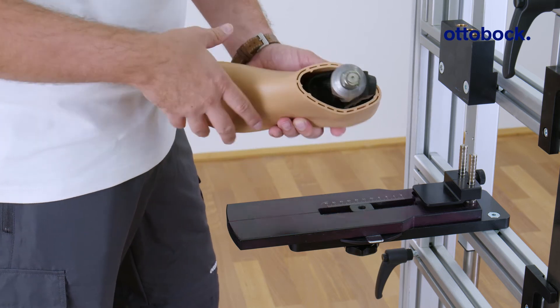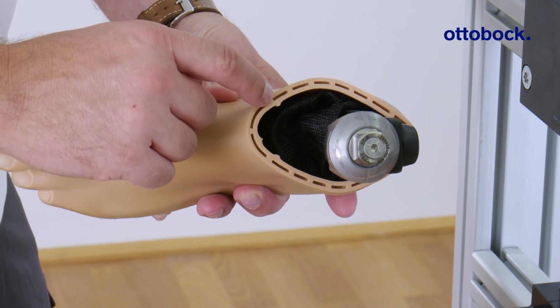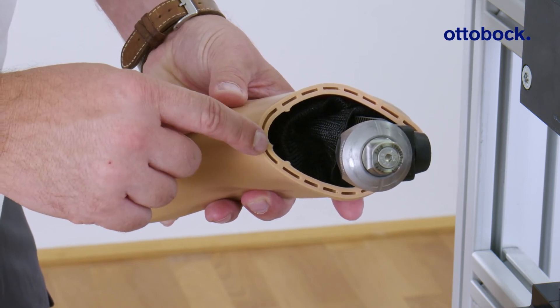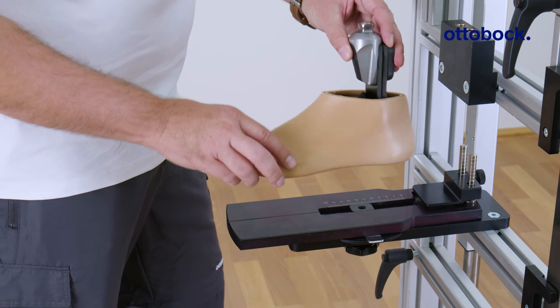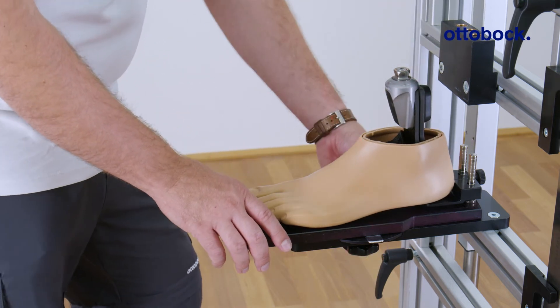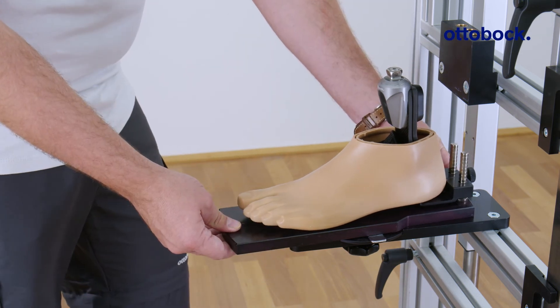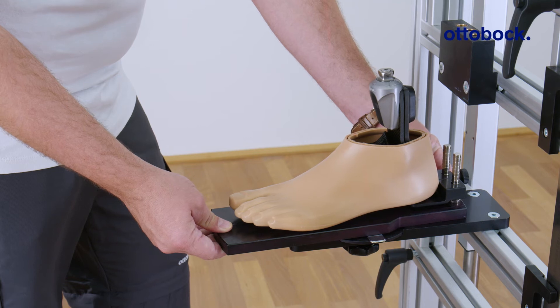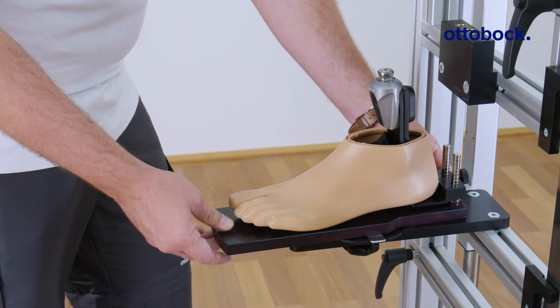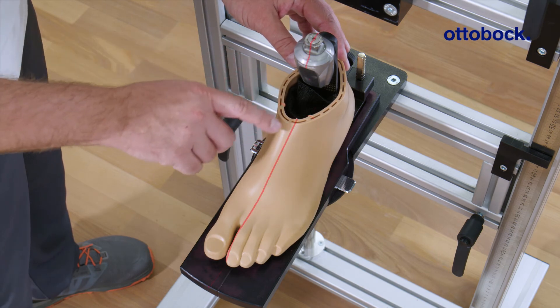Then remove the footshell cover to reveal the alignment marks on the inside of the footshell. Set the outward foot rotation and the lateral foot position so that the alignment reference lines line up with the alignment marks on the footshell. Set the heel height — lateral and medial, as well as anterior and posterior.